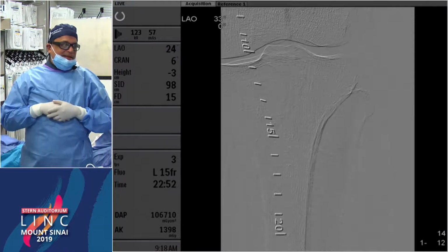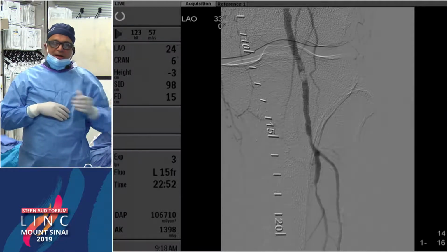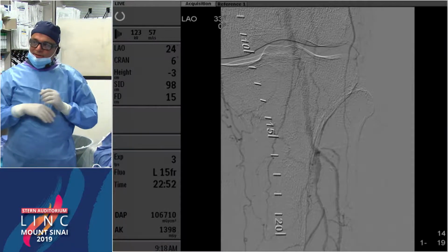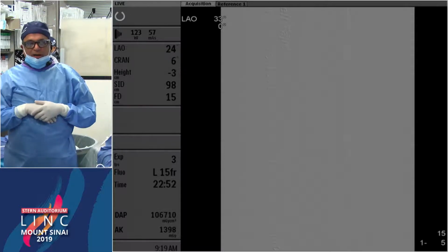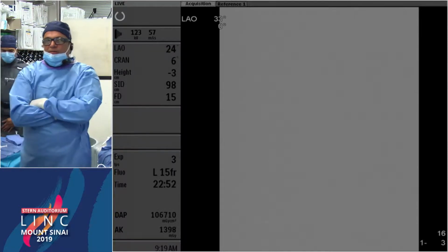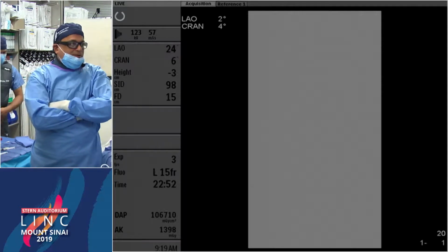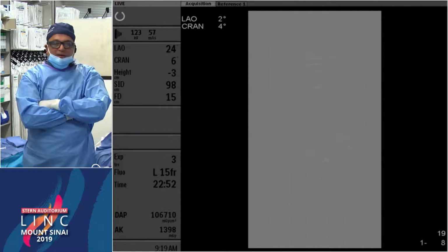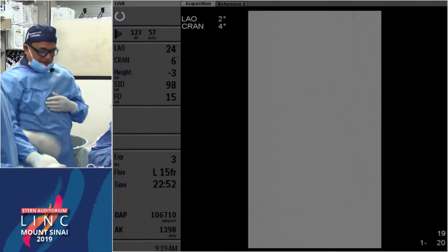So at this stage, we're feeling that opening the common femoral, at her age, she is elderly, but she's active. I wouldn't say quite active, right? She is active. And the issue is whether you think opening this would help. In our discussions with our vascular surgeons here, we feel like it likely will be possible to open this and will help her do better. So I thought in light of the debate, this would be something that we could do. And so that's kind of where we're at.